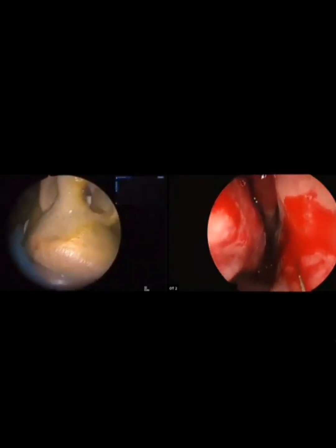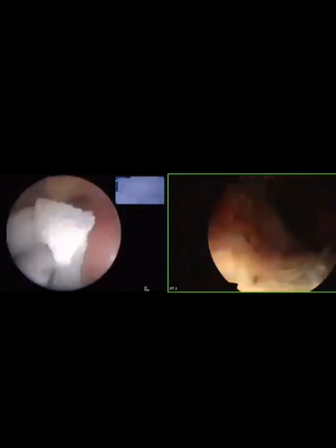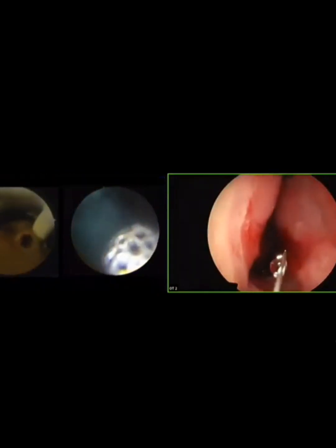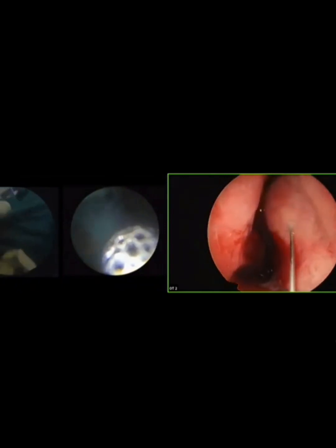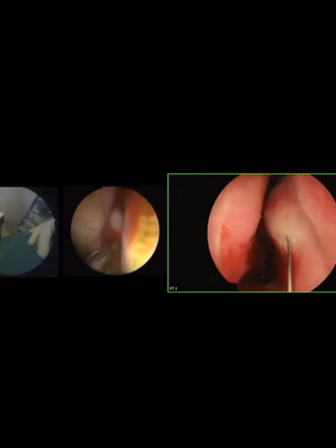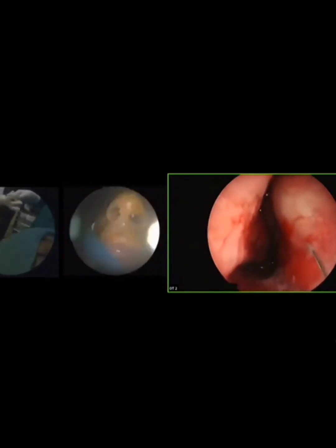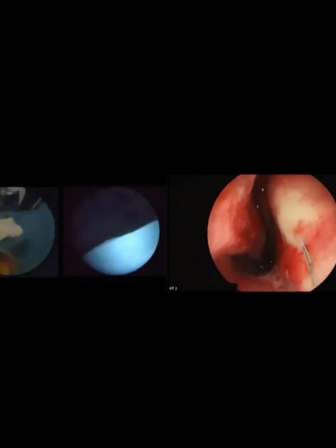In every septoplasty, would you like to go for the CT scan? Yes, sir, we generally get the CT scan done in all patients of septoplasty. But sir, we also have the advantage of being in an institute, so we usually get CT scans done in all the patients.